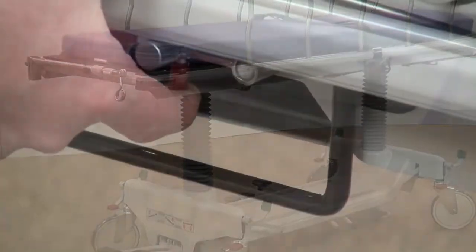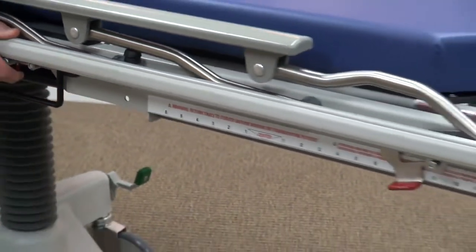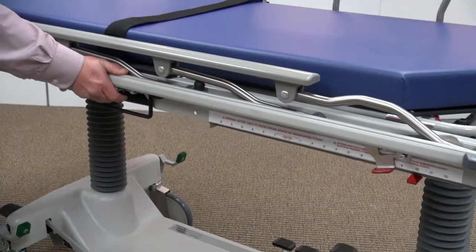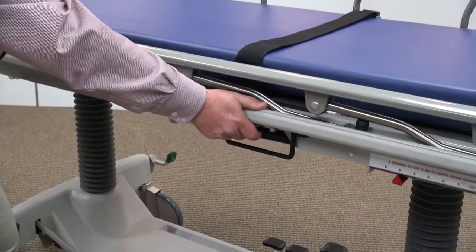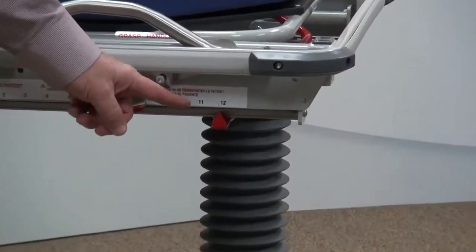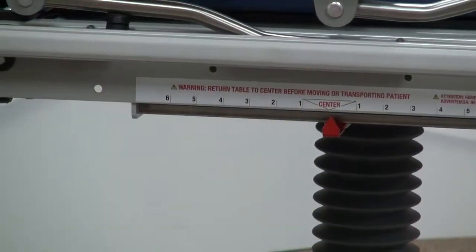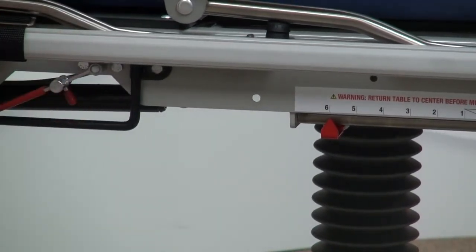This stretcher is designed with a full-length radiolucent translating top that is easy to operate, enabling a broad range of imaging capacity without repositioning the patient. The translating top has 18 inches of movement. By pulling on the red safety pin, you can engage the top to slide 12 inches towards the foot and 6 inches towards the head, reducing the need to move the patient or C-arm, thus enabling shorter procedure times.